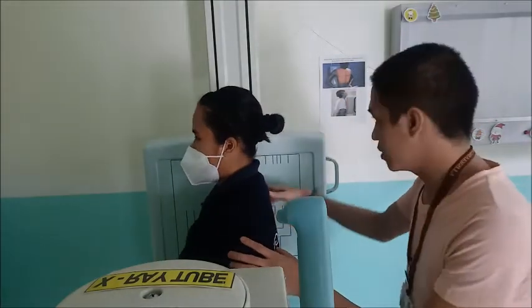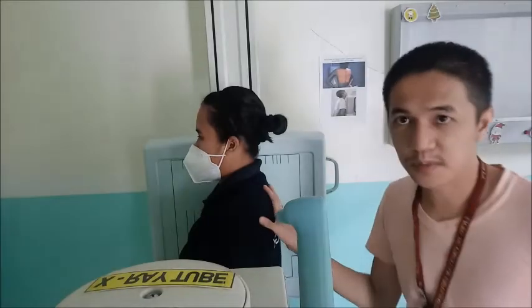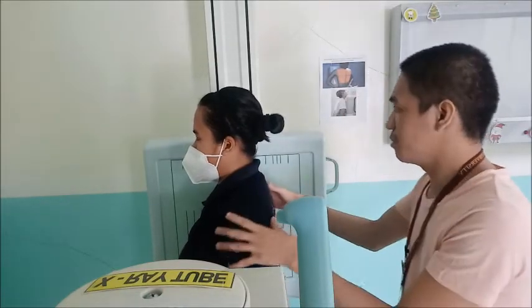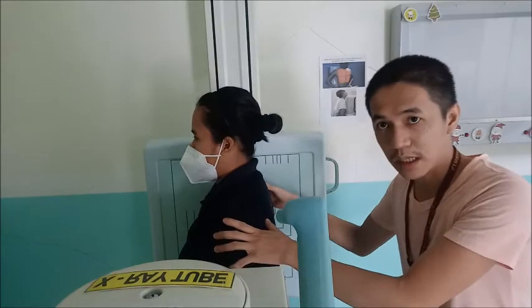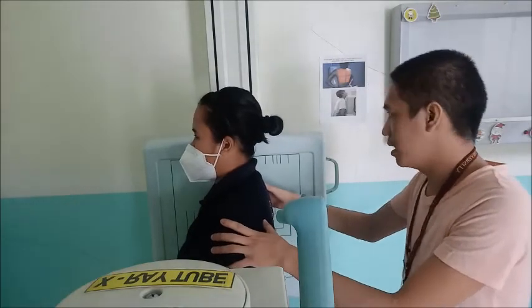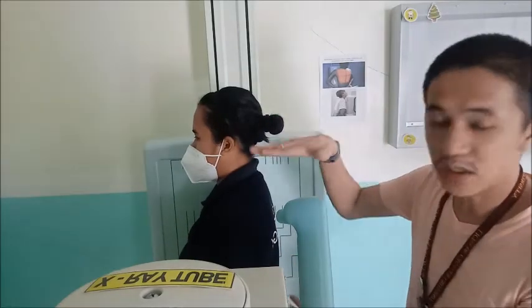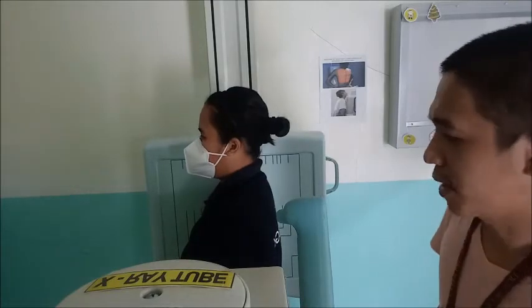So same ito kanina sa chest PA. Kaya nasigo man siya kanina sa apex padulong sa iyang base. Ito siya yung costophrenic angle. So that means kung magtakilid si patient, nakalateral si patient, the size of the lungs will not change, not changed because of the magnification sa tube.